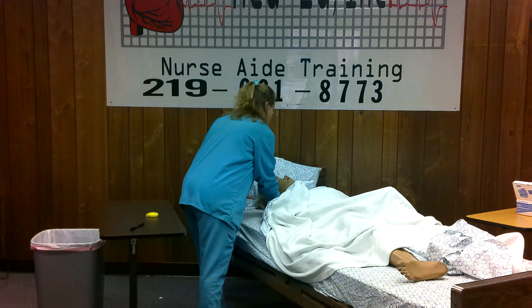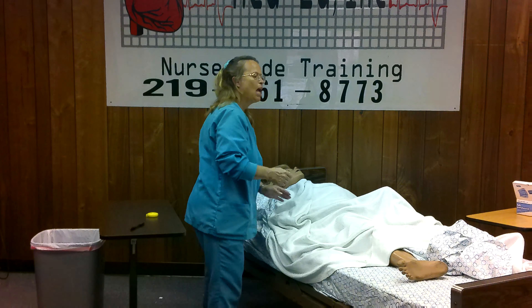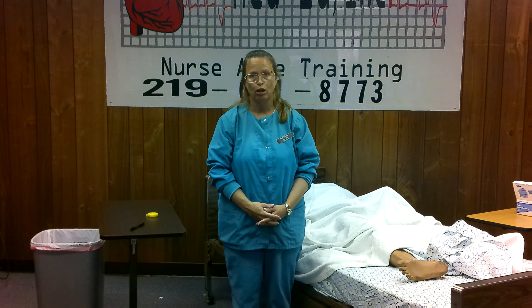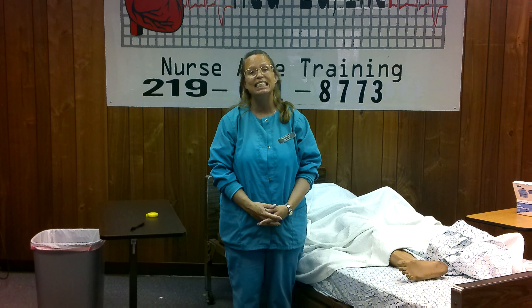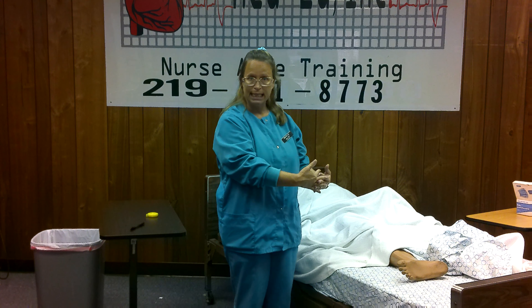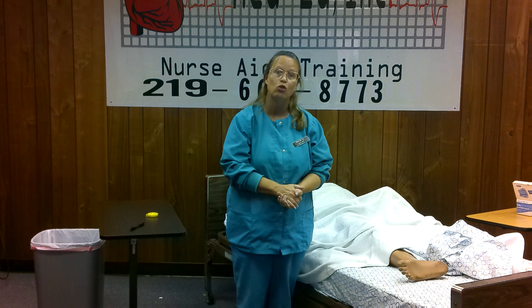Now, this is a mannequin. Some of your residents have a condition called a contracture. A contracture is a permanent stiffening of a joint or muscle. So once residents are contracted, they are not able to stretch out or lay out straight. I'm going to quickly put my resident in a contracted position and then show you how to get their height if they are contracted.